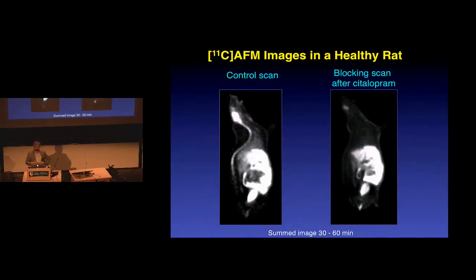Here's a rat image. And on the image, this is a cross-sectional image of the rat. You see the rat brain. We've hypersaturated the image. And there's the spinal cord. And we're seeing this beautiful spinal cord. We're seeing the serotonin fibers in the spinal cord. Hopefully you're thinking, damn, they're small, aren't they? And they are. The goodness.